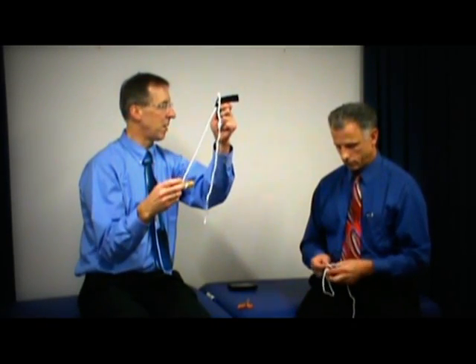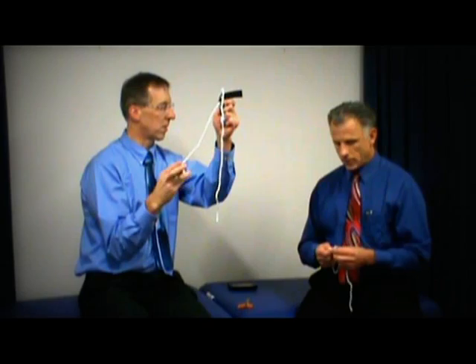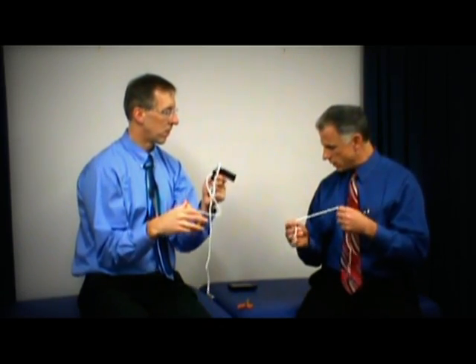Brad used PVC pipe, right? Yeah, half-inch PVC pipe. I cut it about 4 inches long, and then I wish I would have known you were going to do this. I would have brought it long. But if you can't do that, you can go ahead and make your own little loop. Right. Just tie a loop in there.